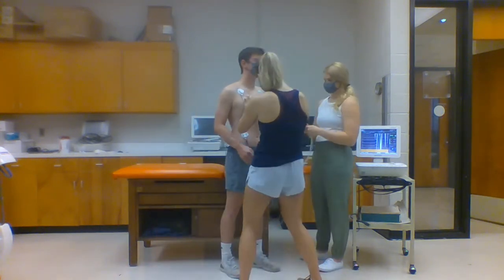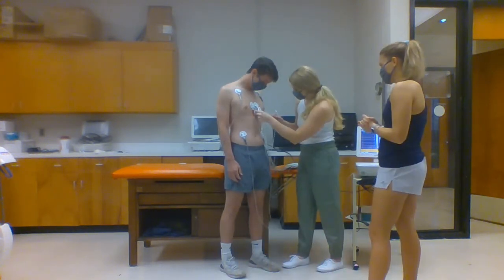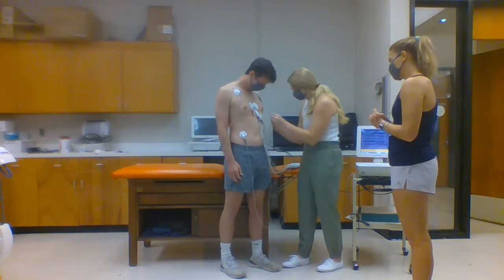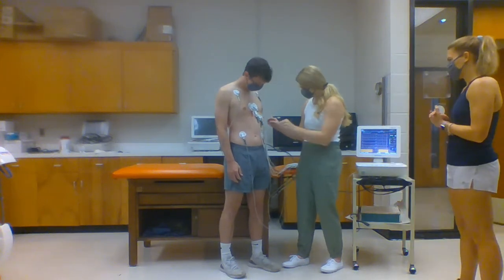The right leg acts as the ground electrode. This wire and electrode must have good connection for the ECG tracing to be seen on the monitor. Similar to the limb electrode wires, the chest electrode wires are also labeled and color-coded universally.